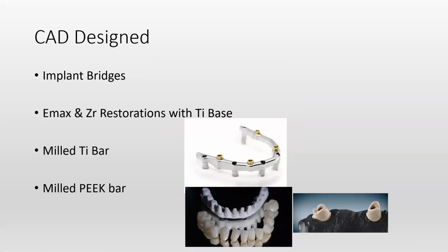We have different options for implant restorations, like Emax restorations with Ti base. Ti bases are one of the most excellent abutments which are available for CAD CAM restorations, and they can be very easily used. And milled titanium bar is another one which is available for CAD designing, and milled PEEK bar. So all these options can be used for full arch restorations.